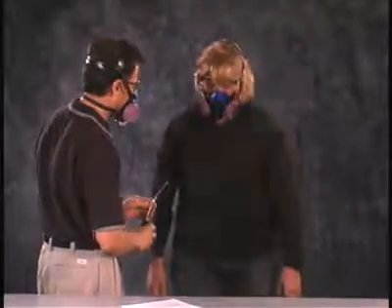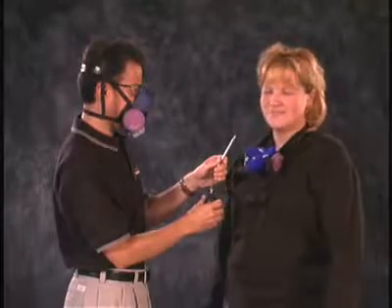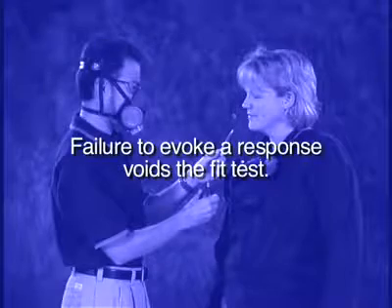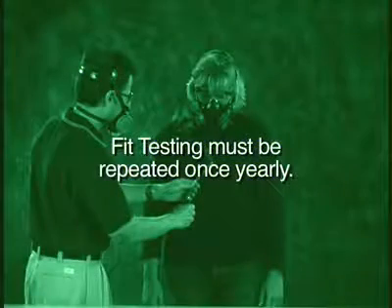If the subject passes the test, check his or her sensitivity to the irritant smoke again. If the subject responds, the fit test is passed. Failure to evoke a response voids the fit test. Fit testing must be repeated at least once yearly.